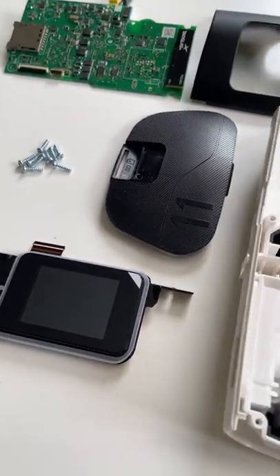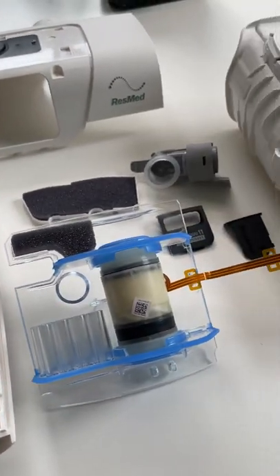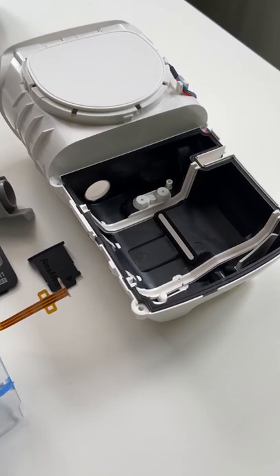I'll do a proper teardown and a full video soon. This is just a little short so you can have a little sticky beak for yourselves. Have a lovely day. Cheers.